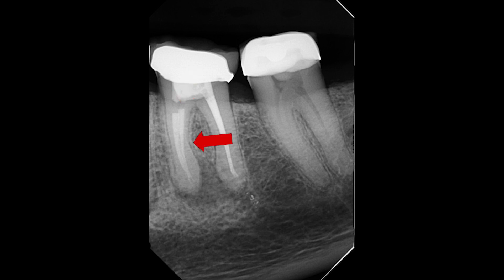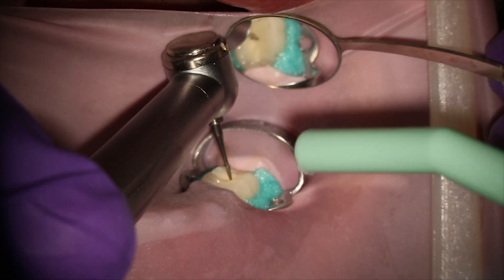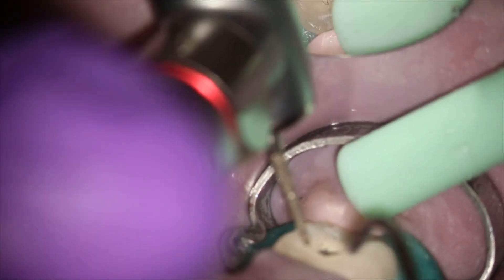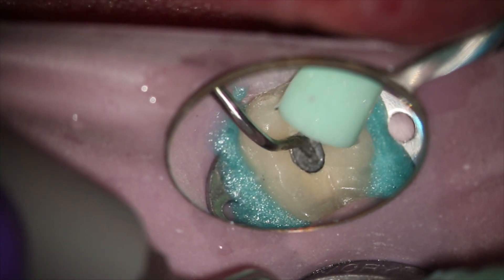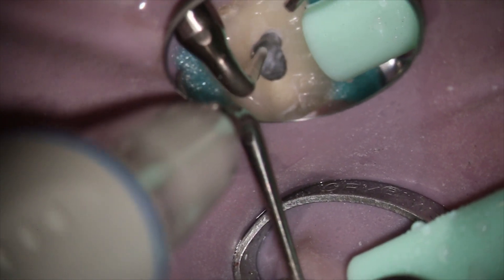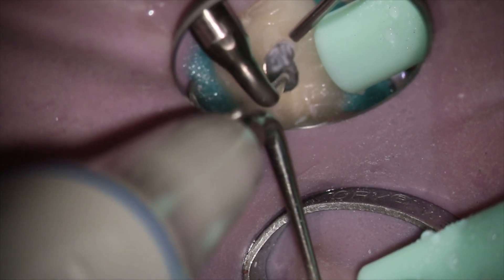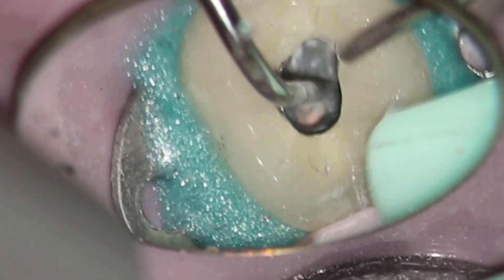I've got the glass ionomer here and I'm thinking about furcal perfs — there are a lot of risks going through my mind. I'm making access into the crown, and I don't really like going in and taking the buildup material out with a diamond; it just seems harder and I can't see with the handpiece. So I tend to do this with an ultrasonic. I'm not sure if it's because I own the ultrasonic company that makes these tips, but I do this with ultrasonic tips instead of a round bur or diamond simply because I can see.